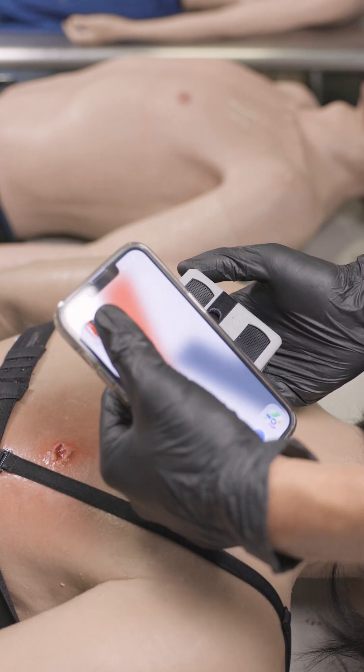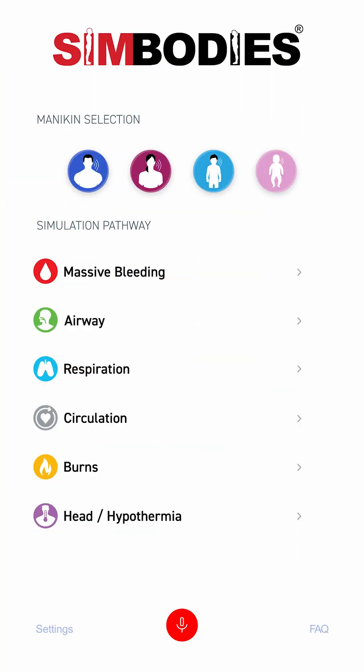Select the app to begin. Choose the category of mannequin you're working with: male, female, child, or infant.